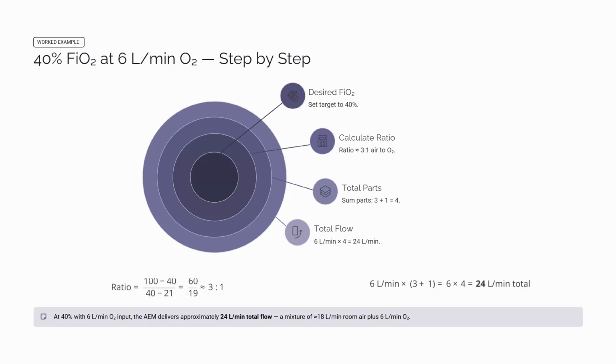And that raises the real clinical question you'll be working through in this class. Once you've calculated the total flow, is that flow actually enough to meet the patient's inspiratory demand? We're not solving that today, but that's exactly what you'll work through together in class. But now you have the tools to do the math once you get there.